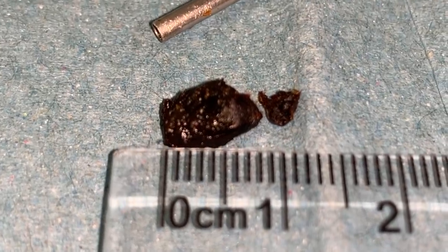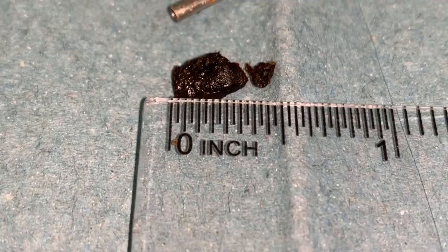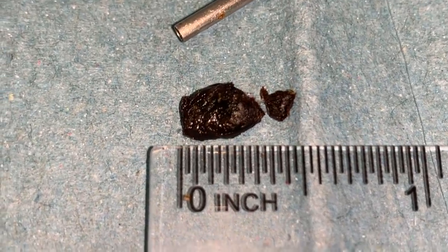All looking really healthy. The left-hand side was the first plug removed; the right-hand side was that little bit from the other ear canal. It's quite dark in colour — it's been sat in there quite some time.